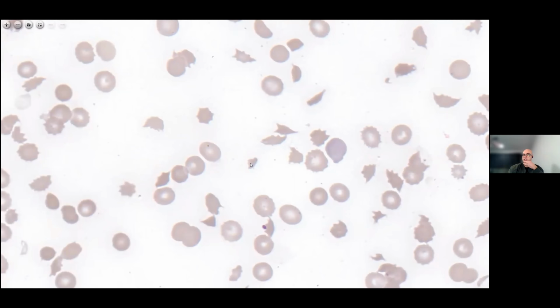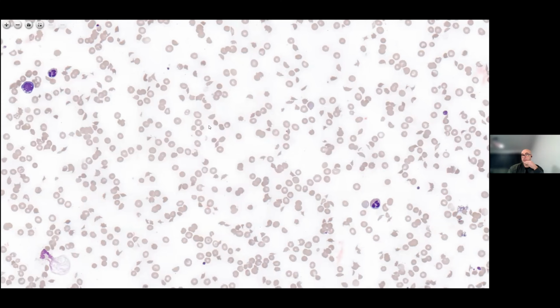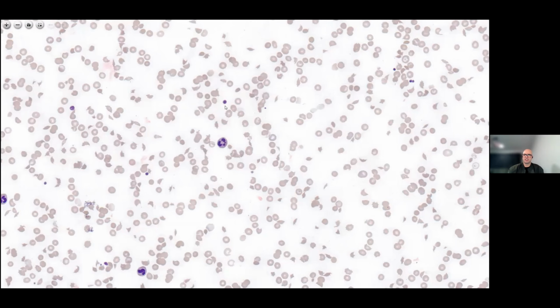Is this potentially causing a falsely high platelet count for this case? And that's where, if you have an analyzer that can do an optical or fluorescent platelet count, it might be able to give a more accurate platelet count. And you might not have to go down the rabbit hole of performing an indirect platelet count or a platelet estimate. You can trust the superior methodology of the analyzer doing an alternative platelet count method. That's if you're lucky enough to have a laboratory with optical platelet count or fluorescent platelet count.